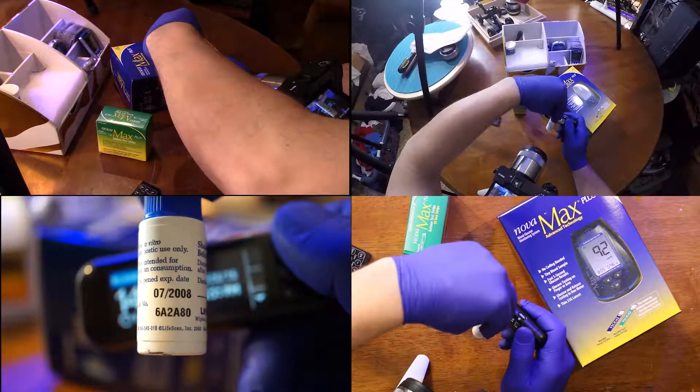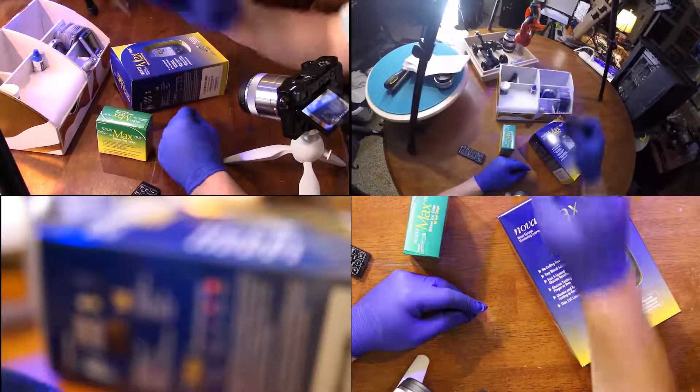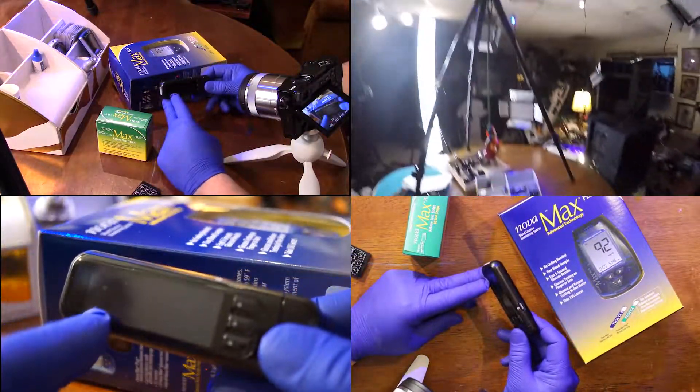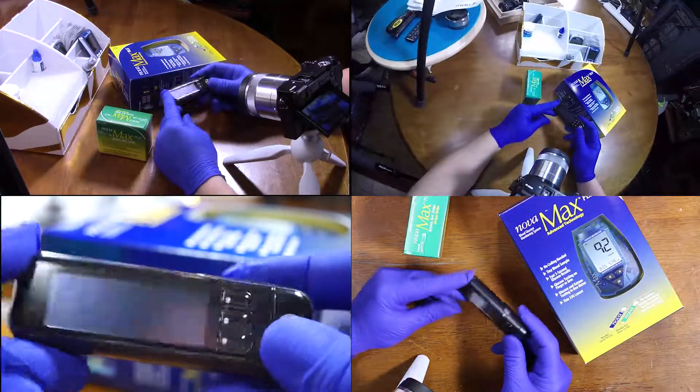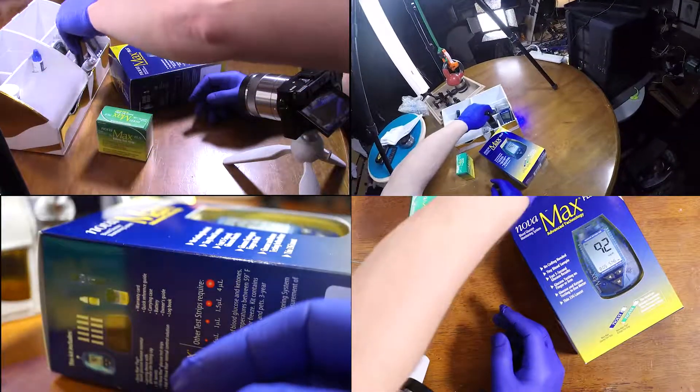There's an expiration date of 07-2008. So we might go ahead and bring all these out and do a comparative test.